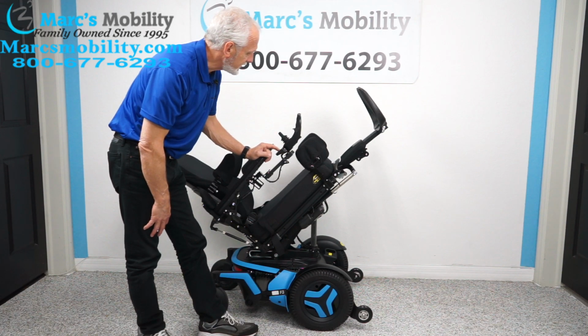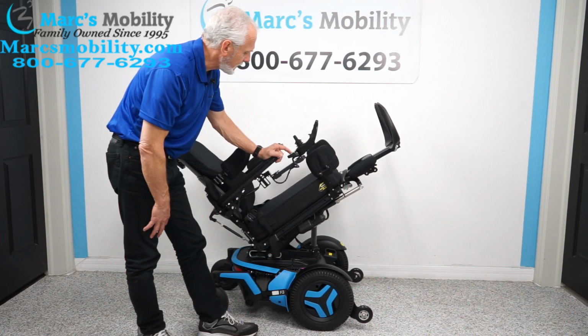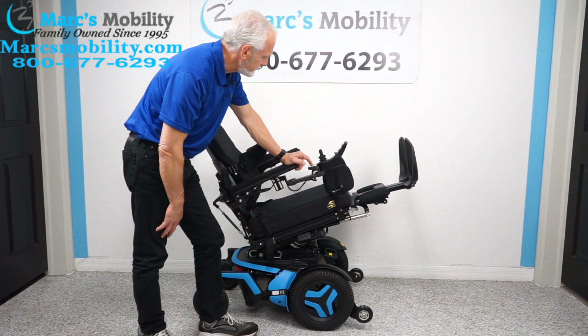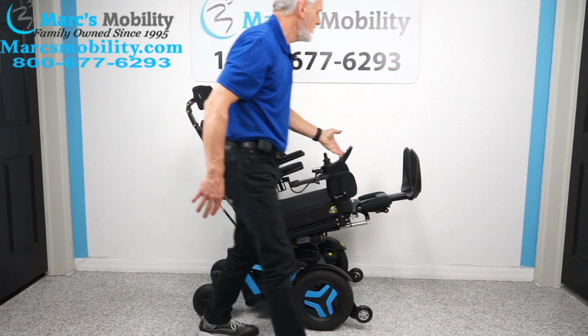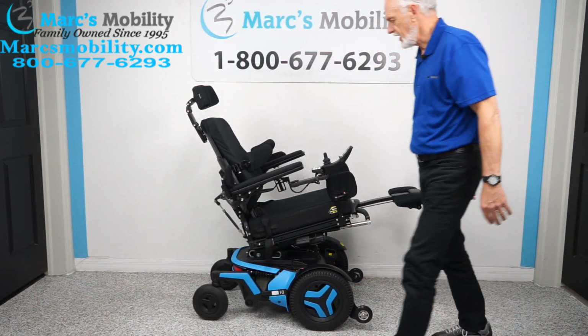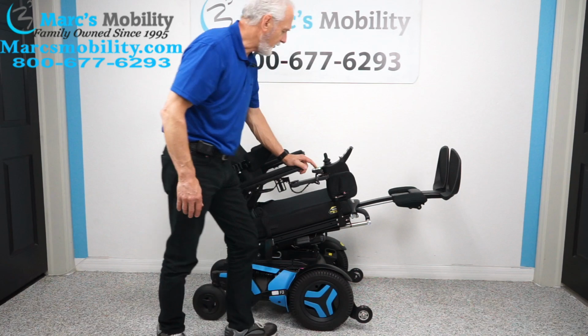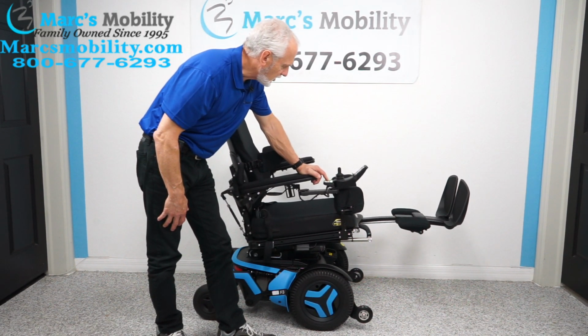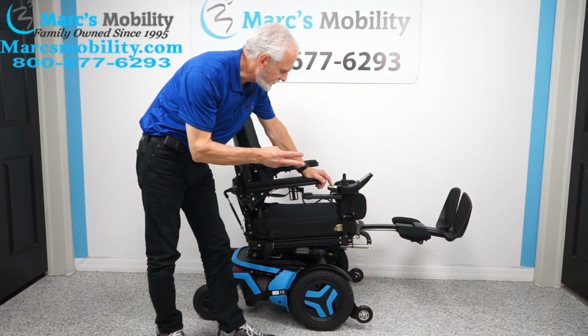Now, if you're halfway tilted, we're going to go halfway down. This would be maybe right here, a little more than halfway tilted. You can see your feet are still higher than your body, okay? So that would be the halfway tilted with your feet all the way out in front of you. Now we're going to bring that back flat, and the third option is the recline.